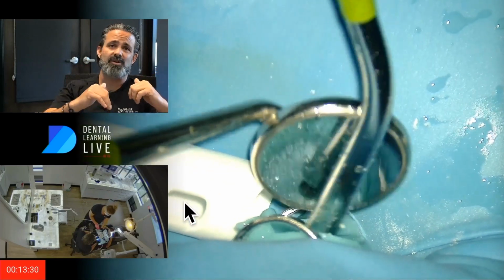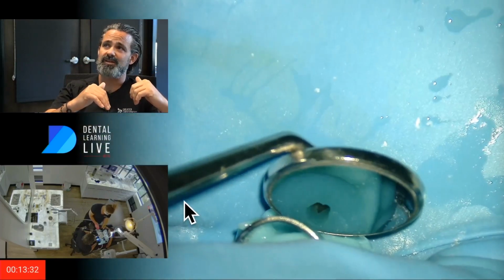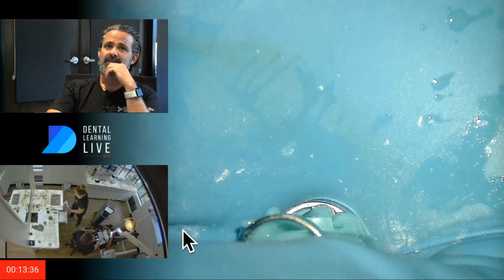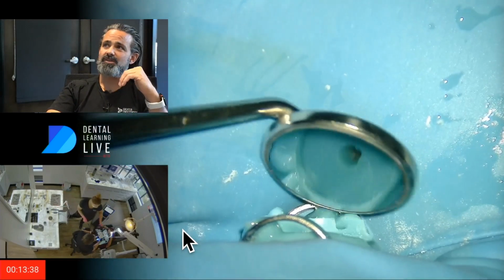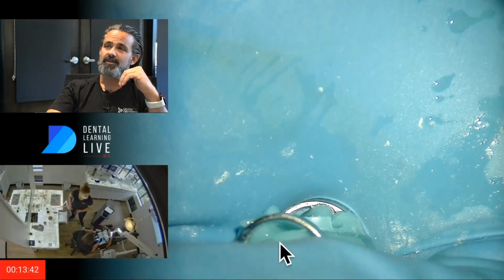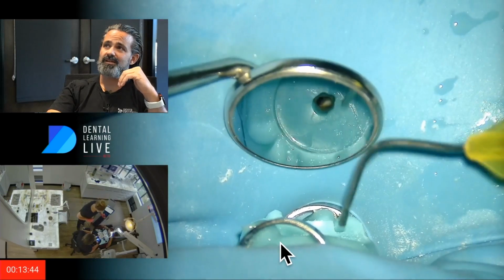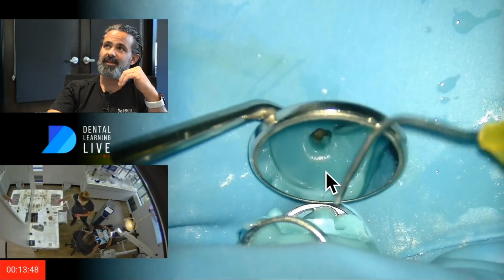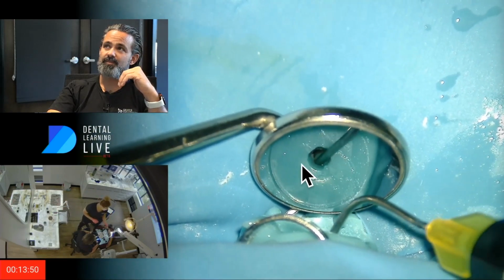It's very soft, so I use a slow speed. I'm not really trying anything. And I'm noticing, just trying to see if there's any air pockets or bubbles there. And I felt like there was one right there, and you probably saw that. So I'm just taking some more Sound Seal, and I'm just gonna put that in and then just smooth it back up against the wall.